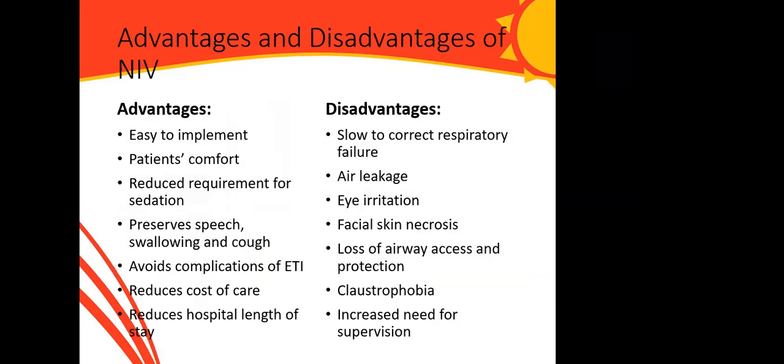There are a lot of advantages and disadvantages of non-invasive ventilation that we need to consider. Number one of the advantages is that it's easy to implement. Like we said, it does not require endotracheal intubation or a surgical airway. It affords patient comfort, and there's reduced requirement for heavy sedation and sometimes muscle paralysis.